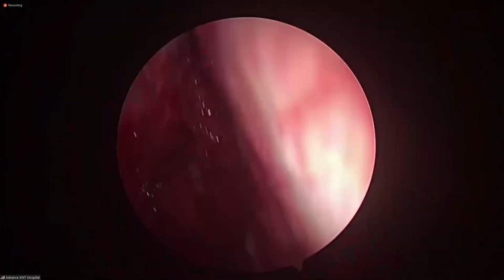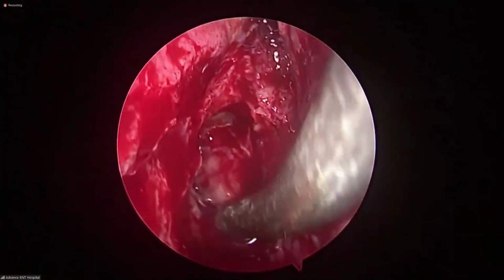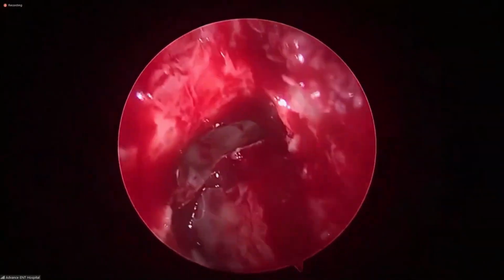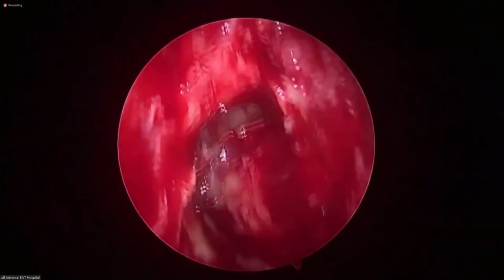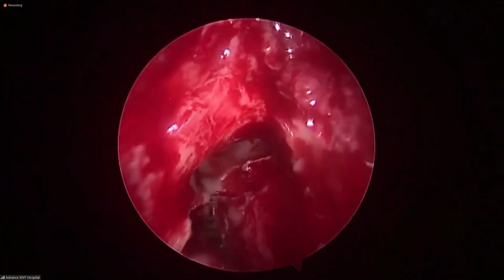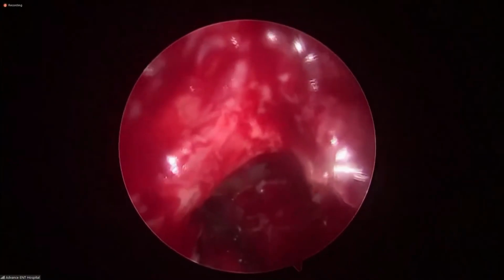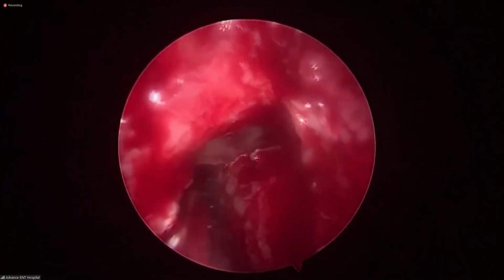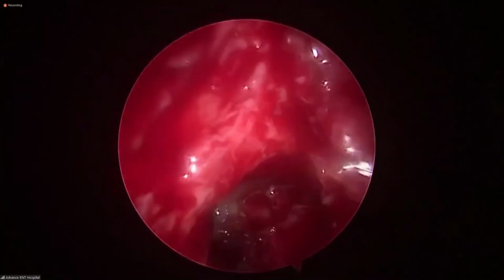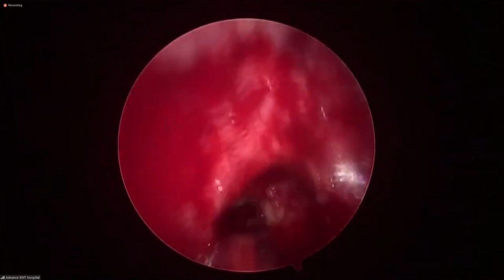Give me over there, one minute. Let me widen it and then show you. You will never forget. Remember with the curette, how did I break that cell? Towards me.